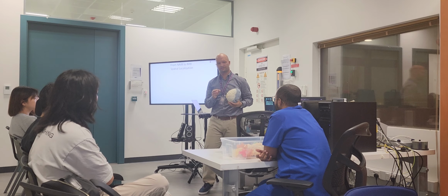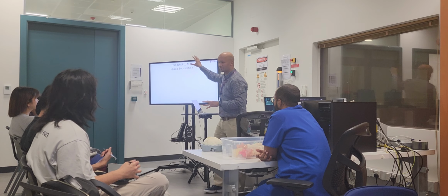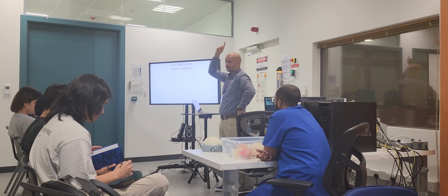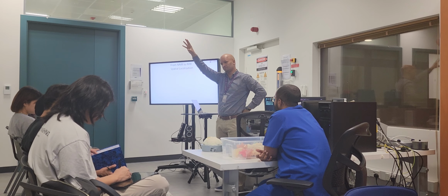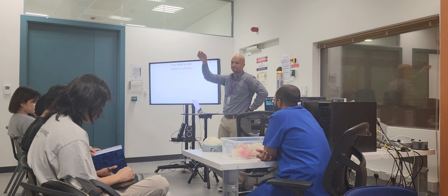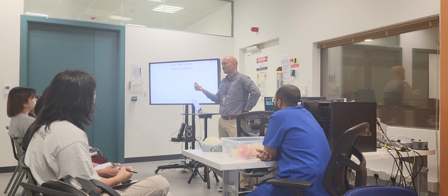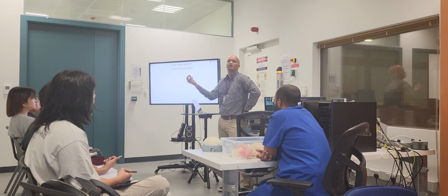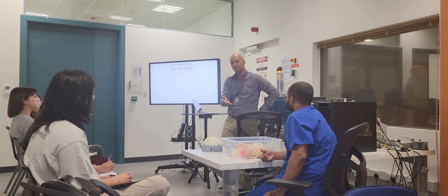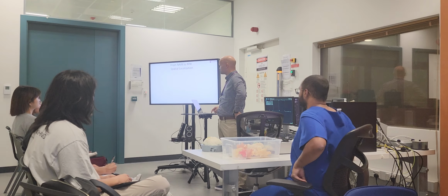Okay, so now, did you study gradients yet? Okay, good. So that's what upgrades an NMR spectrometer, that's what you have in ERB, an imaging machine. We can add an imaging module to those NMRs to make them imaging. But an NMR by itself cannot spatially localize where the signal is coming from. Ideally, you want a sample that's very homogeneous, and you get one signal from the whole sample. It doesn't work for a brain with a tumor on the left side, in the sensory cortex, to be specific. So we need some spatial localization.